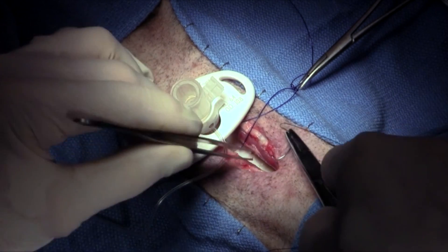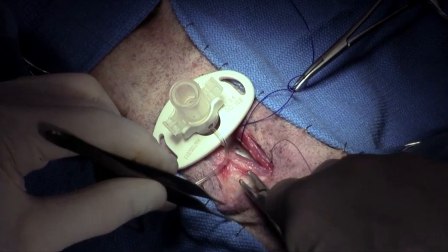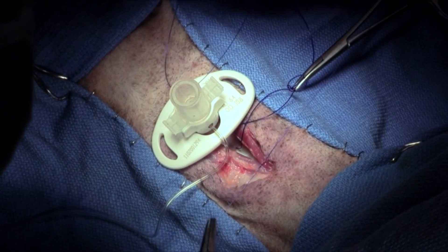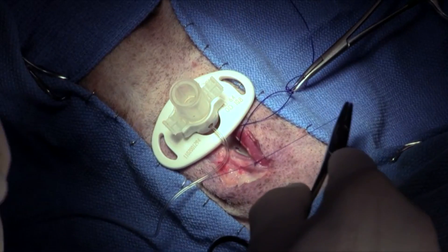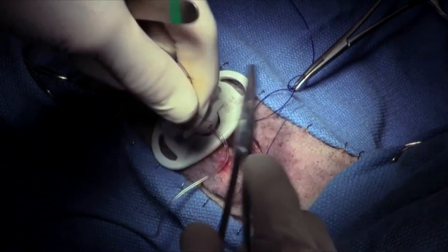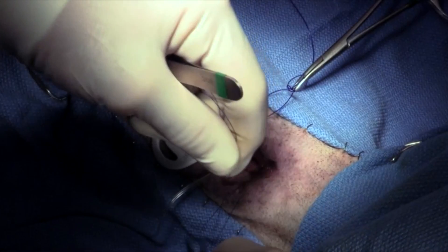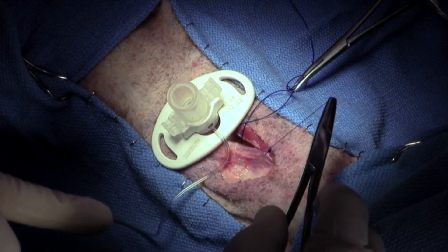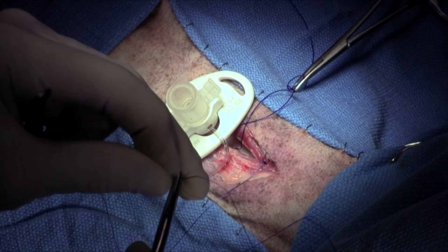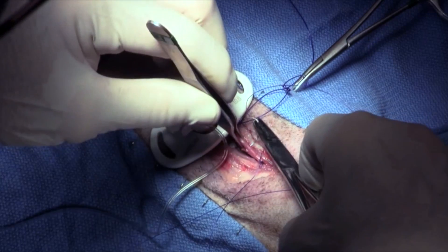Closure of the surgical wound is by loose apposition of the sternohyoid muscle bellies. There is a natural tendency to want to close the sternohyoid muscles in a tighter apposition around the tracheostomy tube. This can be a mistake: if the muscles have been sutured too tightly, subcutaneous emphysema can result when the tube is removed, because air passes from the wound rather than being allowed to escape loosely.